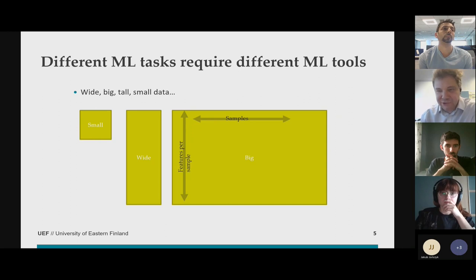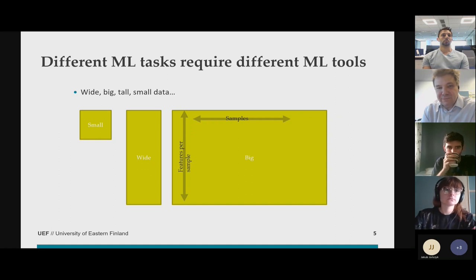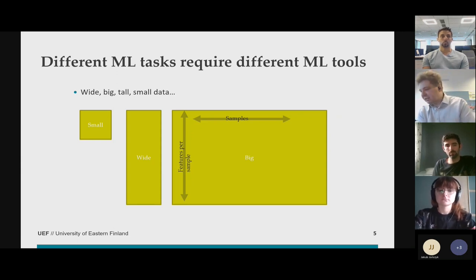And deep neural networks is of course one thing. So what is big data in medical imaging? Well, segmentation is one example, because our samples are not individuals, but they are voxels. So this brings us to the big data regime, and we can actually use these tools that have been developed in machine learning and computer vision circles and adapt them wisely to our application so that they make changes.